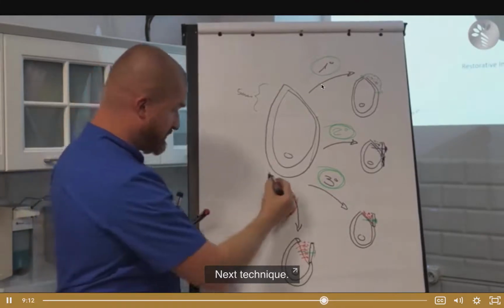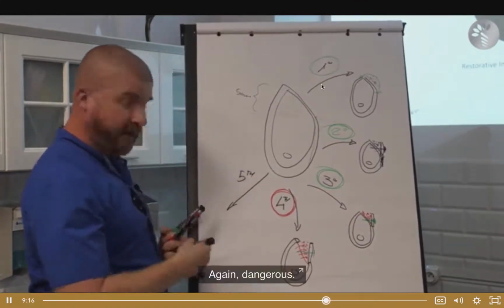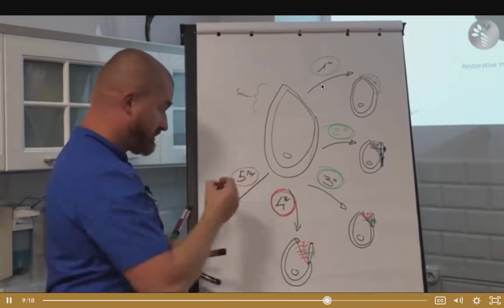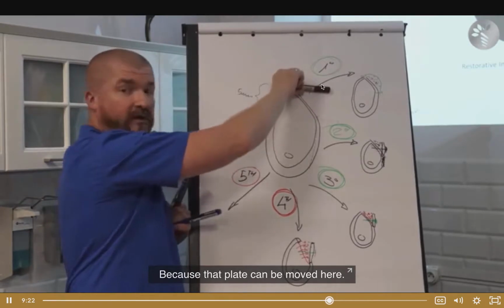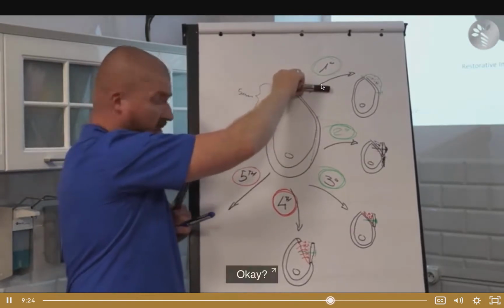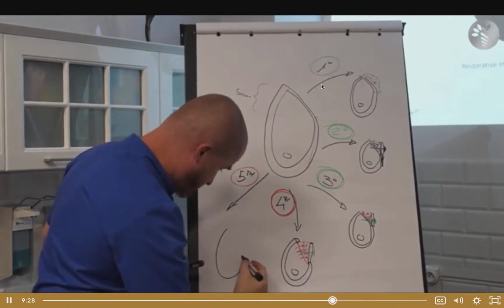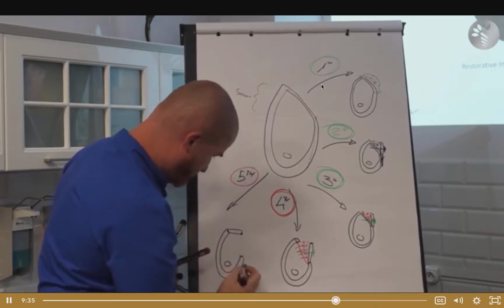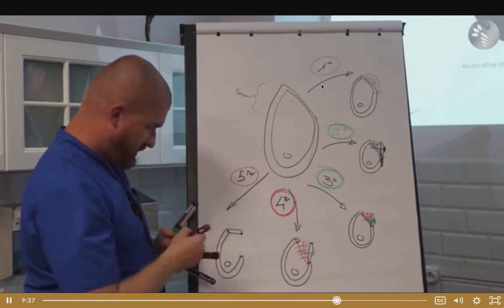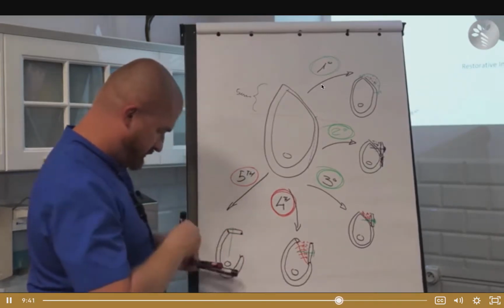Next technique, fifth. Again dangerous. Why? Because that plate can be moved here. Okay? So let's do it. We can fix it by screw too.